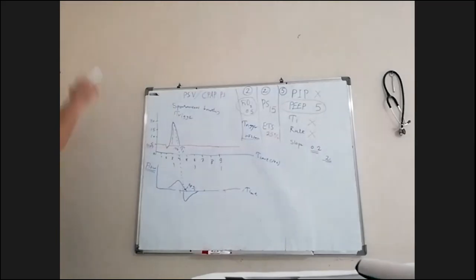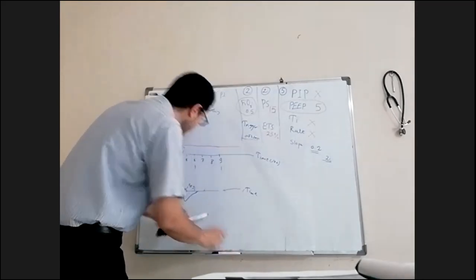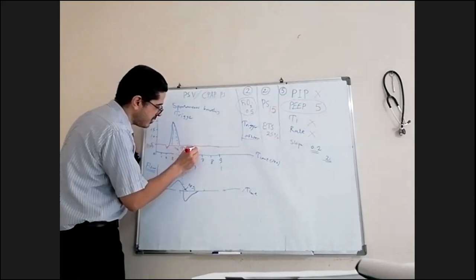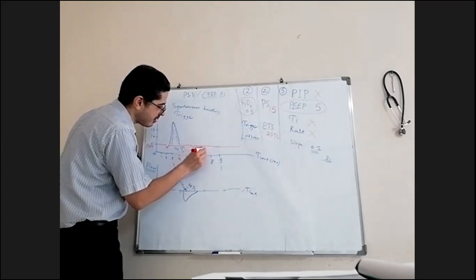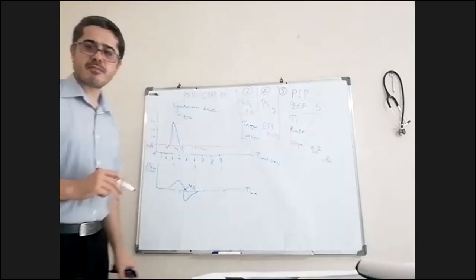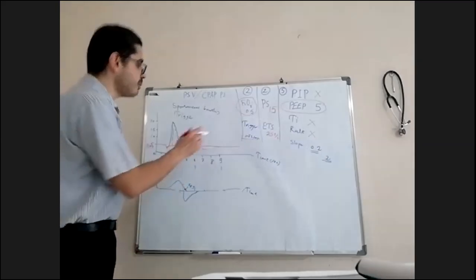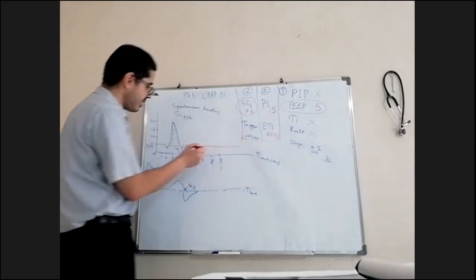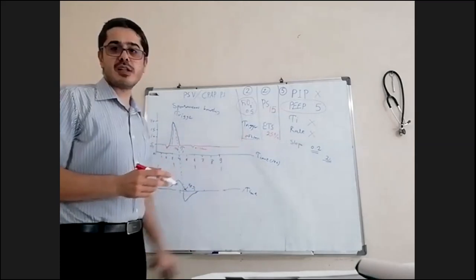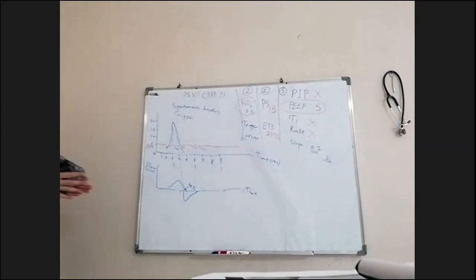Very good. So it will always be like this unless, let's say at one point of time, the patient created the flow, but that flow was only 0.1 liter per minute. He did not reach 0.5. Do you think he will get the pressure support? He will not get it, because the setting here is that the trigger is 0.5. If the patient takes just 0.1, he will not get pressure support. He needs to achieve that trigger. So this is the pressure support ventilation.